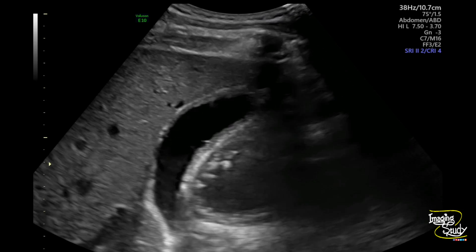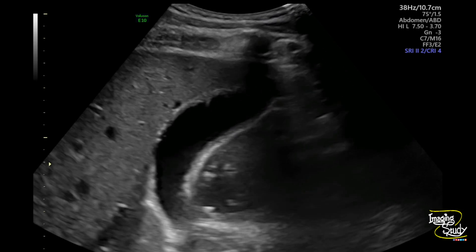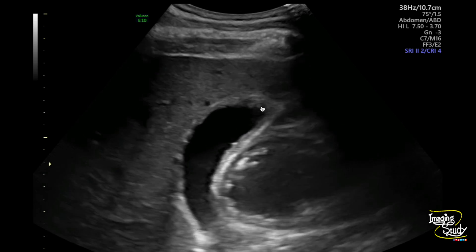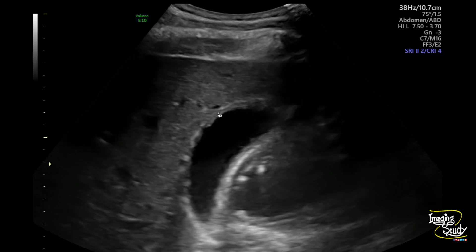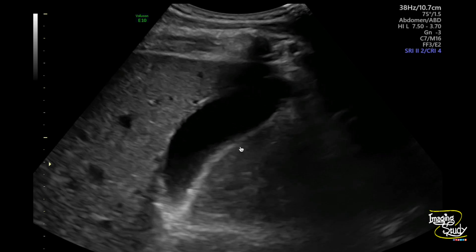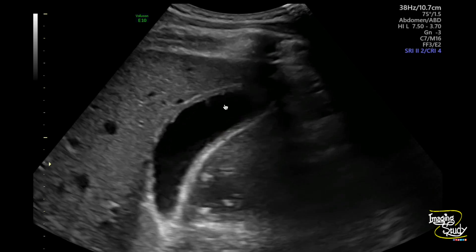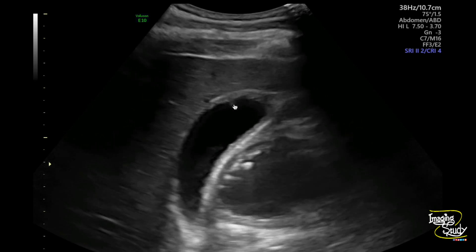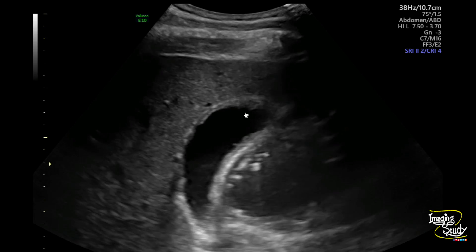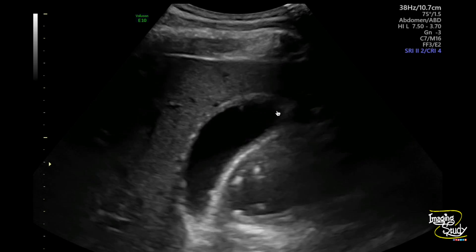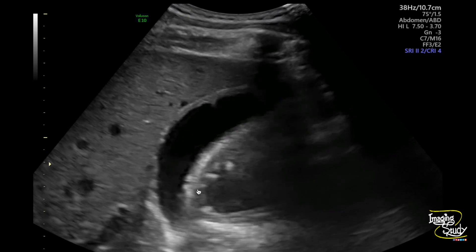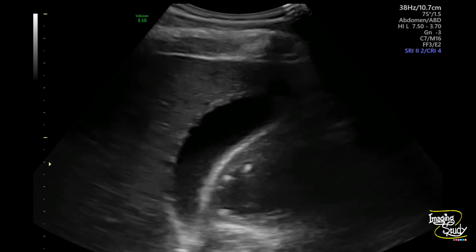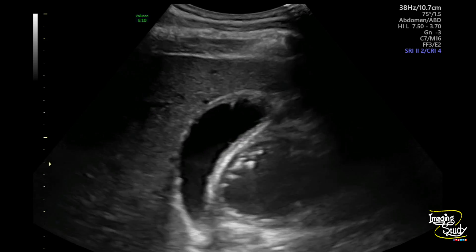Here you can see the long section of the gallbladder. You can see the wall looks thickened but the inner wall is slightly irregular. If you look carefully, you can see near the fundal region there are some tiny comet-tail artifacts. This type of irregular thickening with comet-tail artifacts indicates adenomyomatosis of the gallbladder.